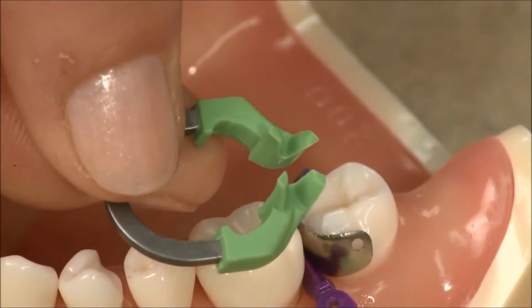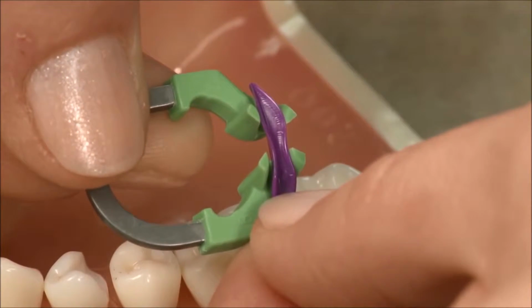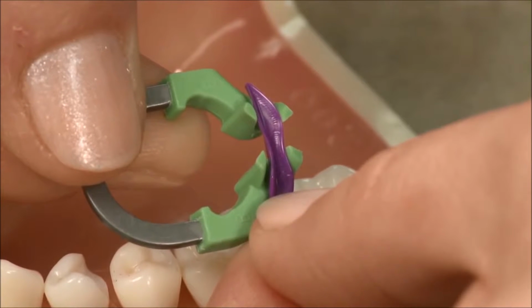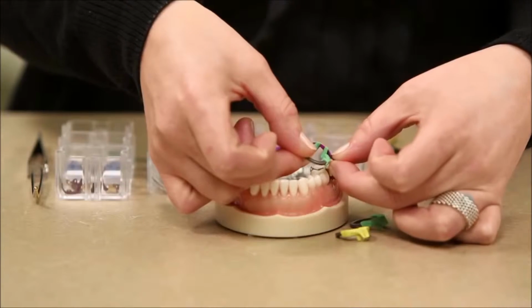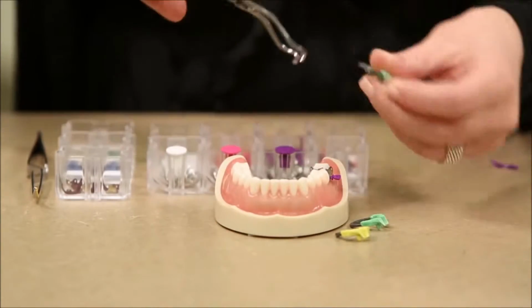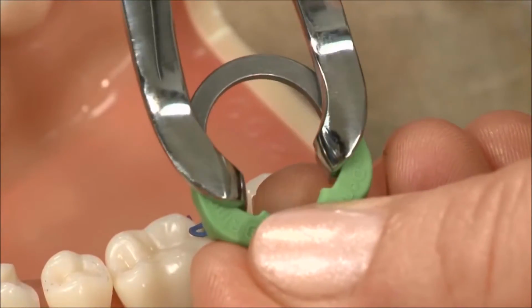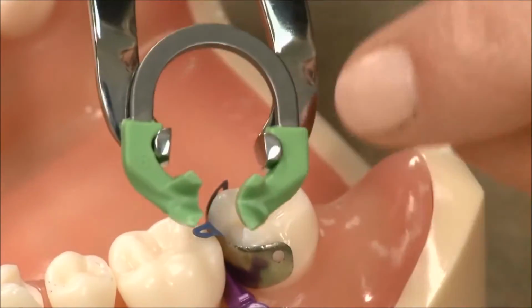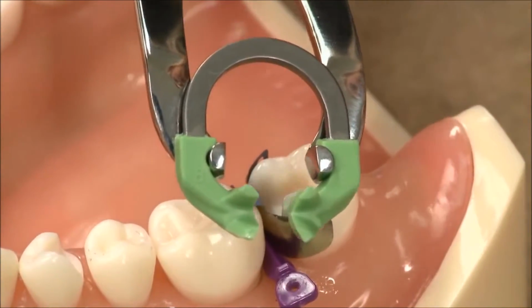The V shape in the tines is actually going to sit right on top of a triangular shaped wedge. So because of that, it's nice and stable and it sits really well on top of that wedge. So when I place this, I'm going to use the Triodent forceps. It fits right inside of these notches, and it actually locks the ring into the forceps so it won't slip off.